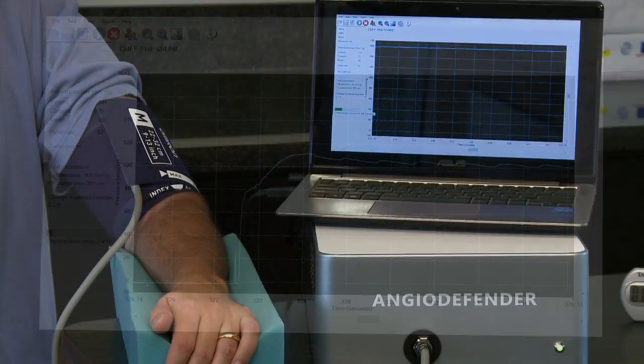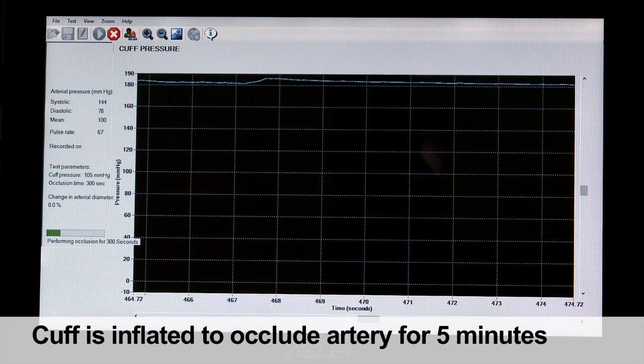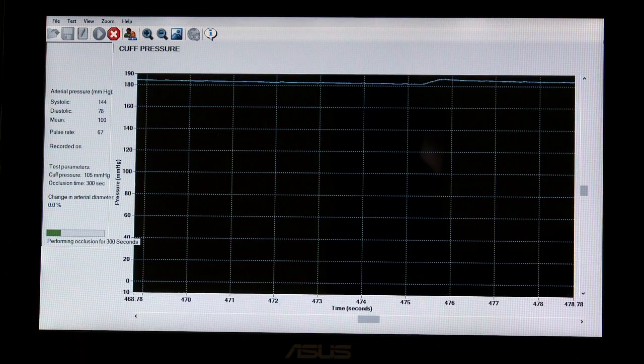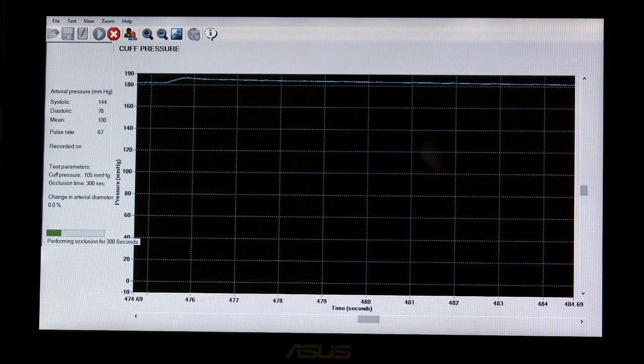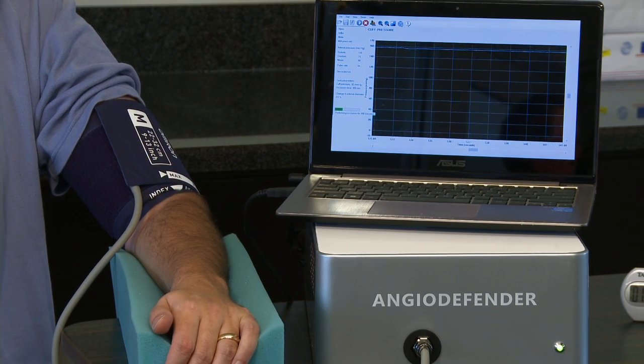Next, the cuff is inflated for 5 minutes to 50 mmHg above the patient's systolic pressure. This occludes the brachial artery, stopping blood flow to the arm. The patient is informed that the 5 minute occlusion may be uncomfortable and there may be some tingling in the hand or the arm, and that while most people can tolerate the discomfort, if it hurts or is too unpleasant, the test can be stopped.